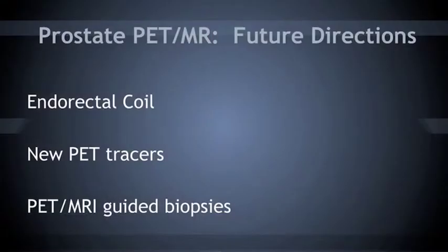In terms of where we're going in the future with PET-MR, specifically with prostate, the issue is endorectal coil imaging. We would like to do that imaging, but unfortunately, the endorectal coil that's devised for the 3T Siemens system was not designed with PET in mind. And attenuation is one of the issues that we're talking about, and any metal components in a device that are in your imaging field are a big problem for attenuation. They will block the photons.